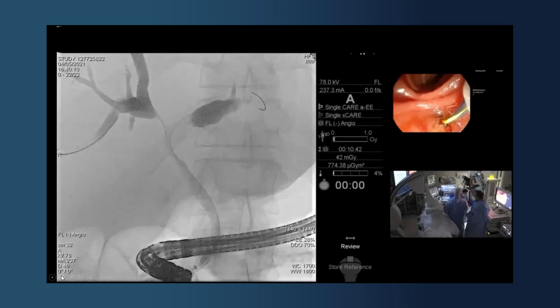So it's always a debate as to whether one should pre-dilate these strictures. What we absolutely don't want in this situation is to find that we get a stent in the left. We normally go for the left first because it tends to be the most angulated. What would not be good is if we get in the left and then fail to get the stent in the right.